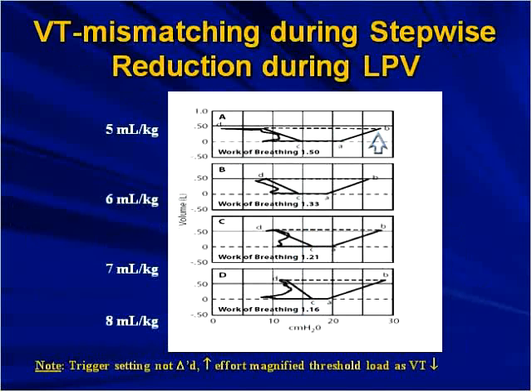So this is why we used higher levels of sedation in patients with very, very severe ARDS, where we have to protect the lungs. And we can see that when tidal volume is set below what a patient wants to protect them, that can cause extreme increases in work of breathing. And you'll also notice that the threshold load, again, this area between the two bars, becomes wider as the tidal volume goes down. This may be a reflection of just the increased respiratory drive, which magnifies the threshold load. But again, it can cause a tremendous amount of patient discomfort.